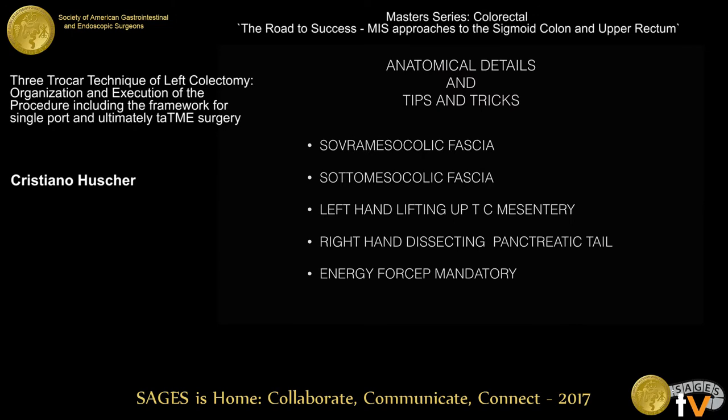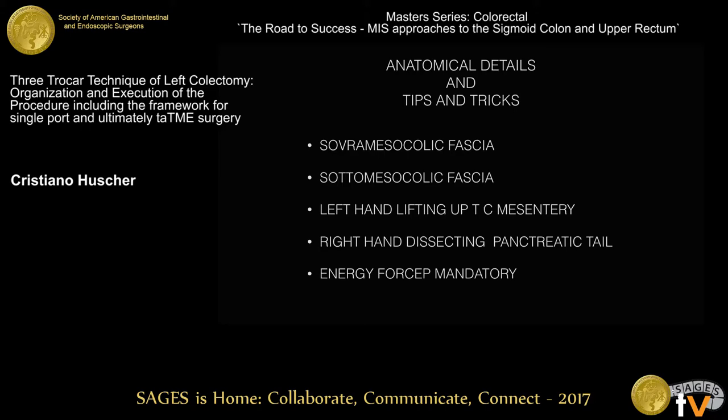We need some important anatomical details. The most important, in my opinion, is to recognize the supra-mesocolic fascia and the infra-mesocolic fascia. Lifting up these two fasciae together and dissecting the pancreatic tail with an energy forceps very deep — in order to achieve a nice splenic flexure takedown. Both techniques can be done.